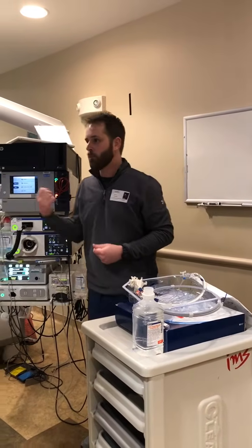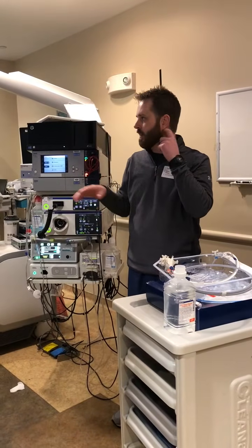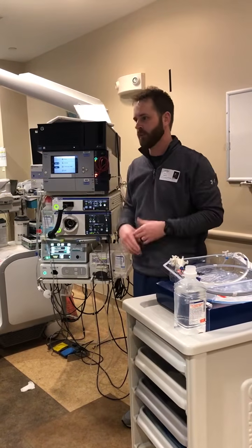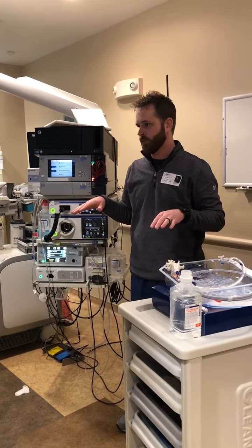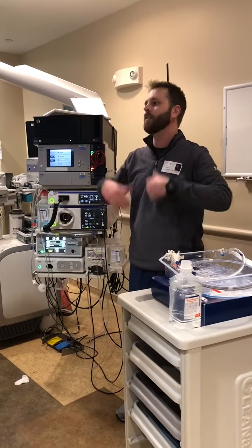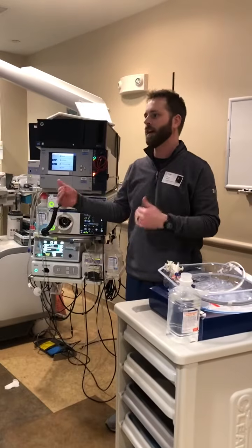When they're doing brushings for strictures, here at the University of Kansas they have access to this technology called FISH. Normally when you do a brushing, you do two: one for path, one for FISH. The results with that are typically about 50% successful. So of every ERCP brushing that you do, 50% of the time that patient is going to have to come back and do another brushing or some different type of diagnostic work to find out what's actually happening.